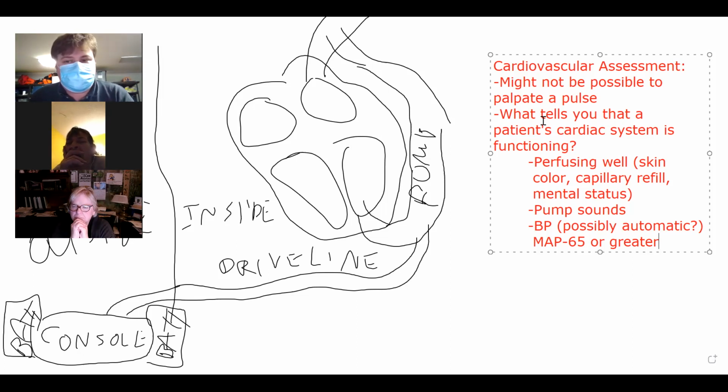Now, what kind of problems do you think might cause a pump to not be able to push blood through from the ventricle to the vessel? Some kind of blockage. Okay. Some kind of blockage. So it could be something like a clot that's forming. You'll find that patients who have ventricular assist devices are put prophylactically on some sort of anticoagulation to reduce the risk of that happening. That being said, it does happen. Some kind of hemorrhage going on. Yep, absolutely. There could be hemorrhage.